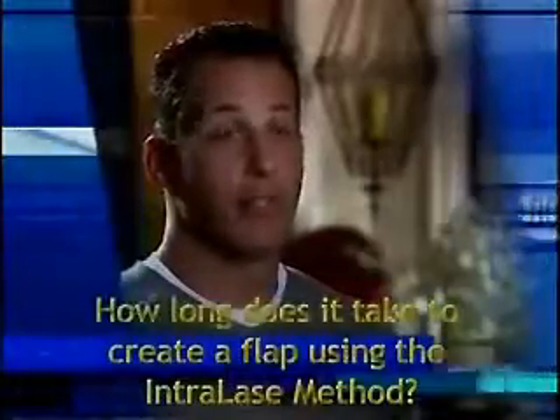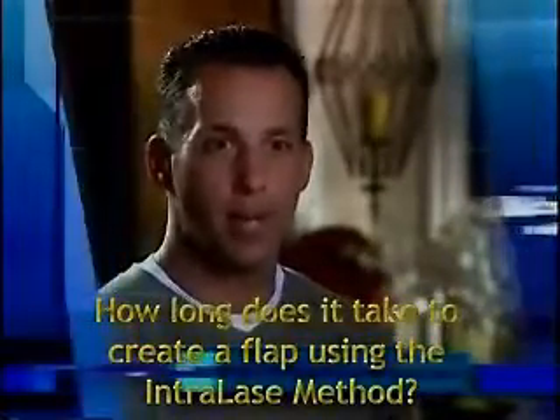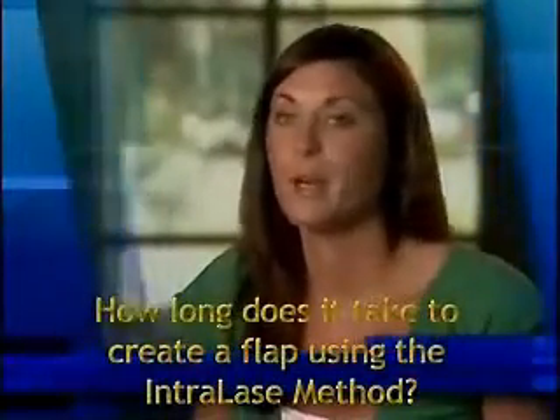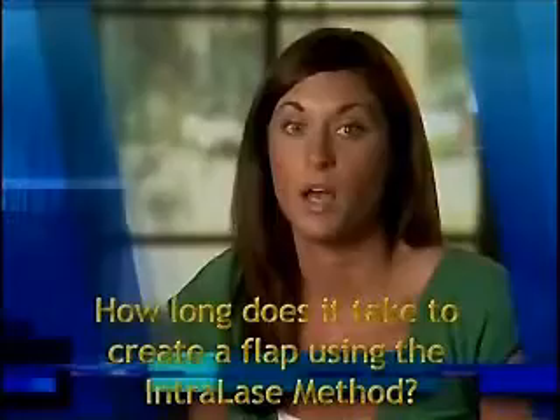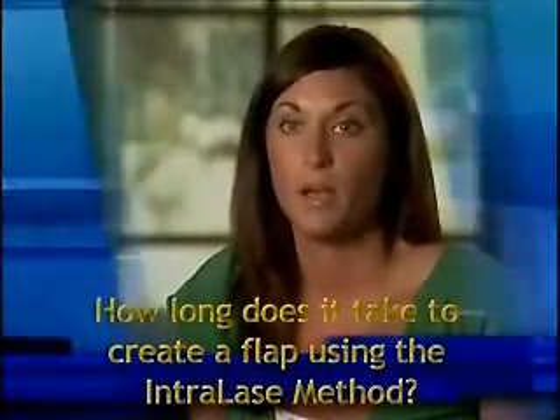Maybe it takes minutes, but it only felt like a couple of seconds. Next thing I know, it was working on the other eye. The procedure for me was very quick. I was in the operating room not very long at all. It seemed like it was over in a flash. My nerves were so high and really by the time I'd settled down, it was over.